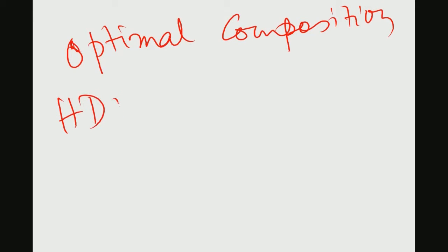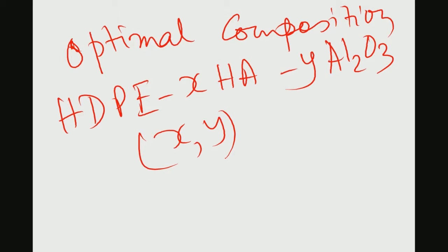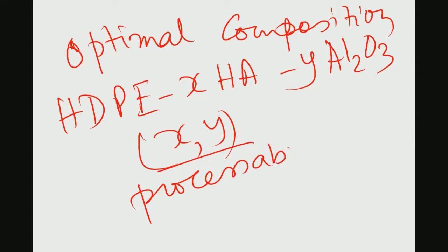Now, let us talk about a little bit of the material science here. Let us say you have high density polyethylene as a matrix and you have x percent HA and y percent alumina. So, first you have to optimize that percentage of x and y. Now, here you have to consider the processability, or ease of processing, versus properties.